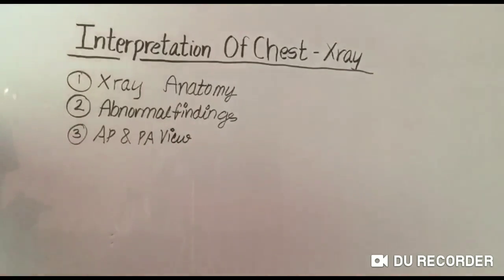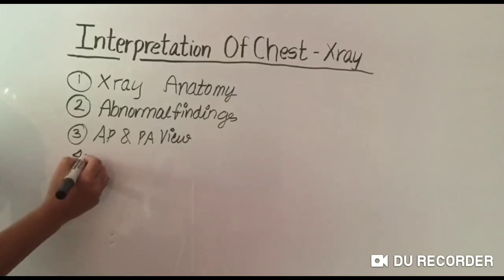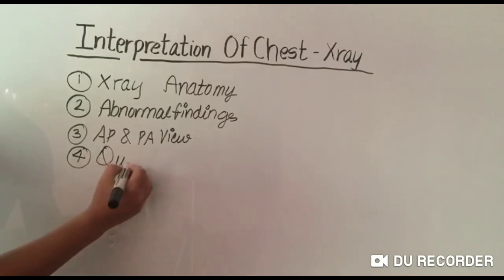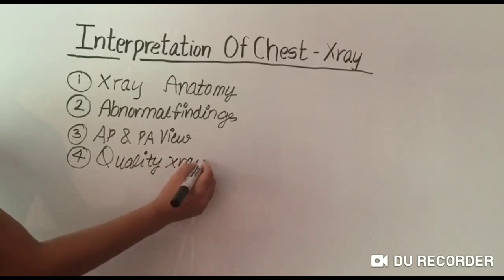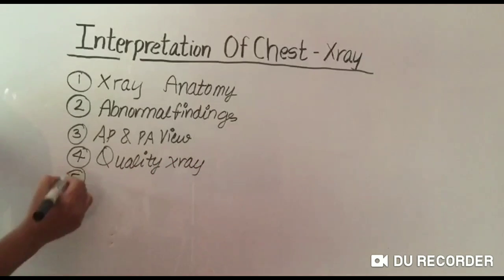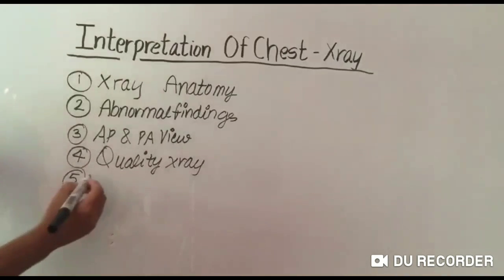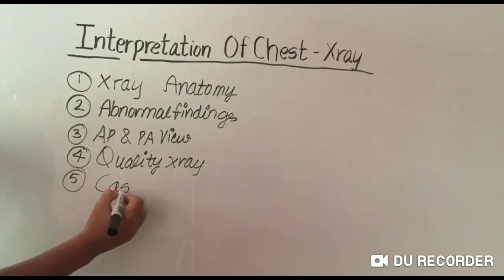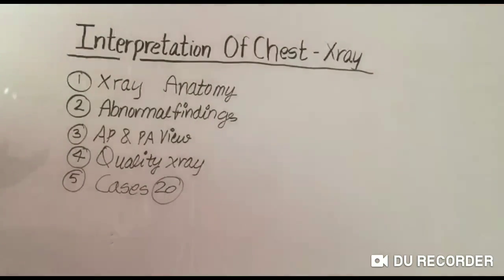We will also discuss the quality of the X-ray, different diseases we can see in the X-ray, and at last we will discuss 20 cases with X-ray.